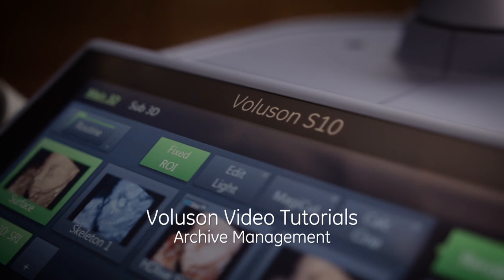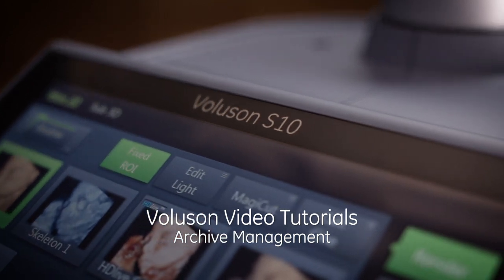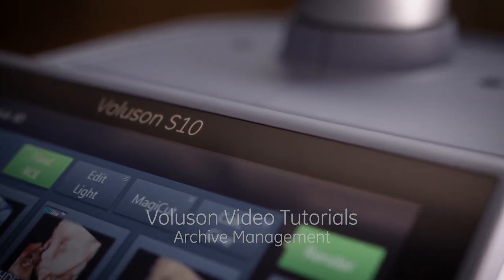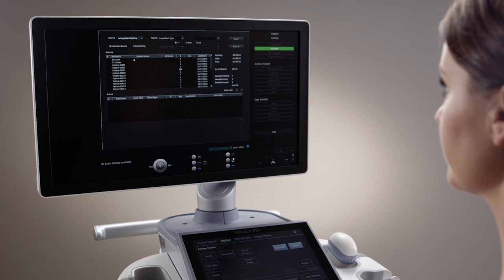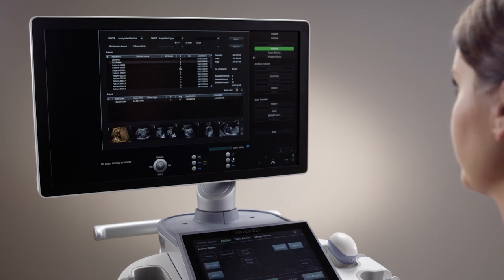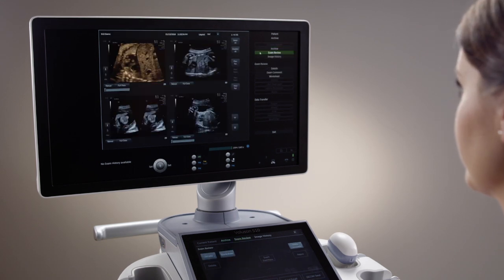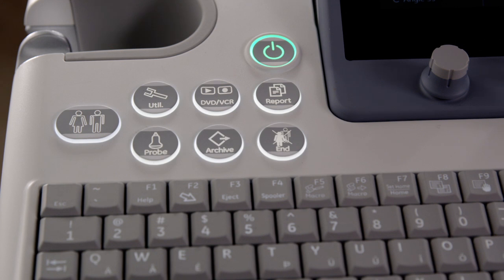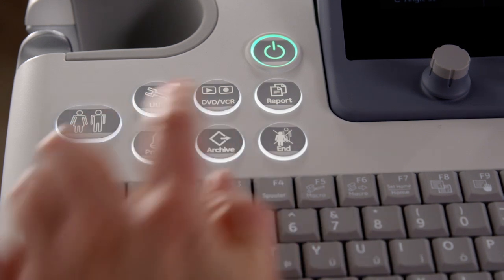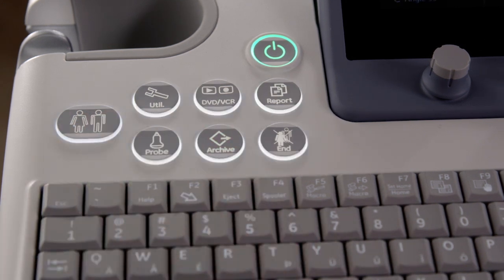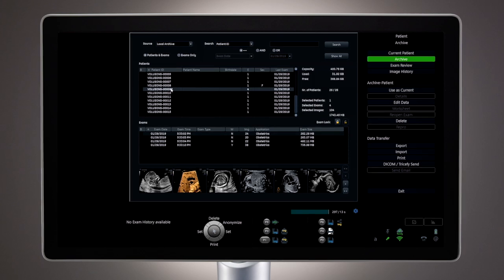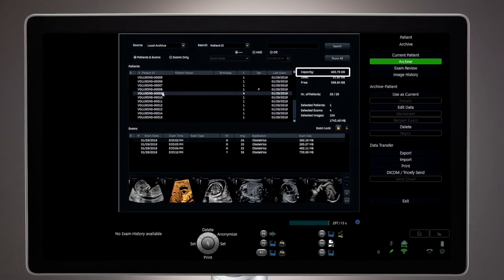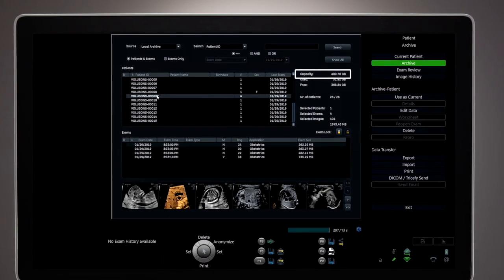Welcome to the Voluson Signature Series video tutorials. Archive Management: The Voluson Signature Series includes a robust image archive that can be used to manage image and data needs. To access the image archive, select the archive hard key. The hard drive comes equipped with more than 400 GB allocated for image management.